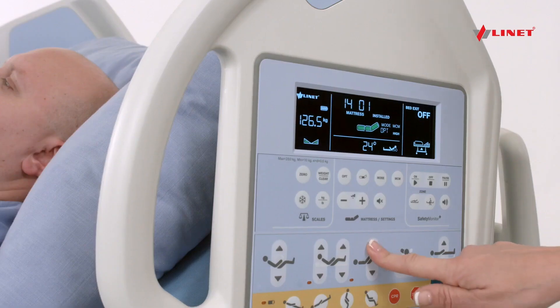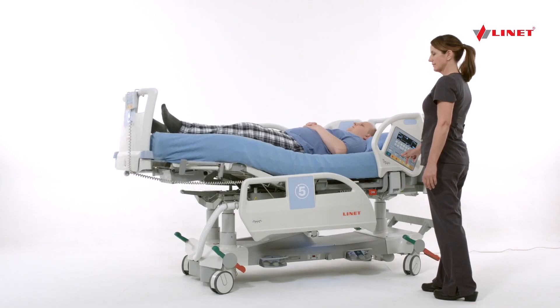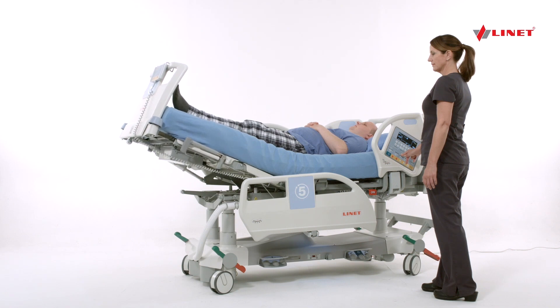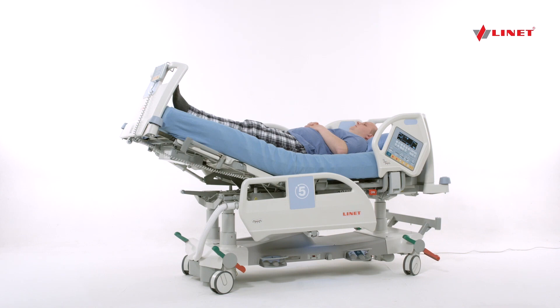Then, using the up arrow, raise the foot section to the desired height. Passive leg raise allows assessment of fluid responsiveness. When utilized, this non-invasive procedure is performed with sepsis bundles.